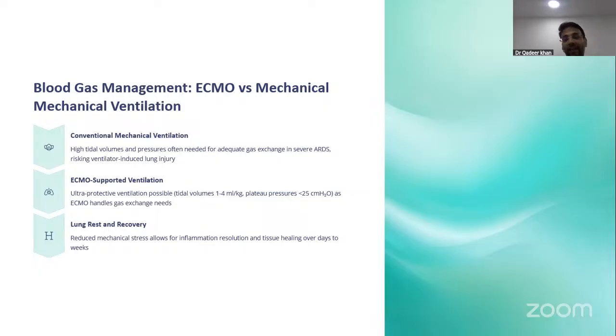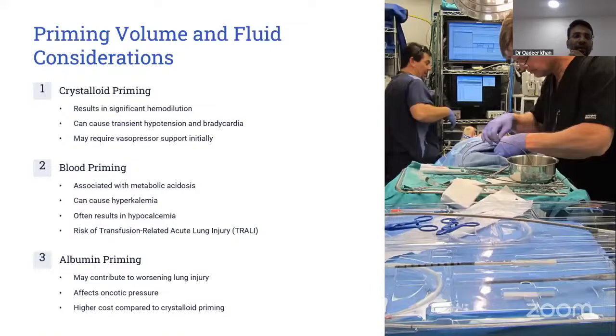If your cardiac function is poor, the patient initially may require full ECMO flows, but later on, because of complications of the ECMO, again the patient goes into cardiac stunning and all. We need to know the venting strategies to maintain that. How do you promote again the physiological effects of priming fluid? Also, when we prime the circuit, the priming fluid also has an impact on the physiology.